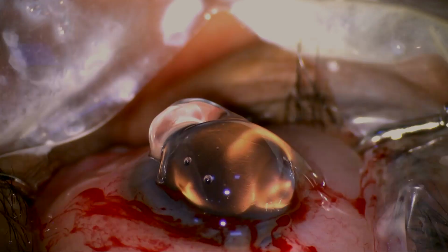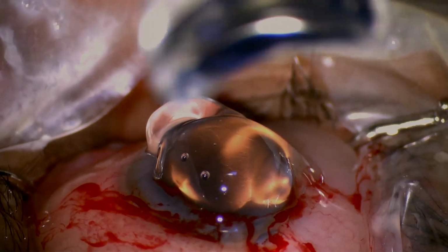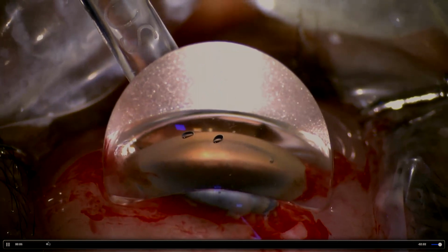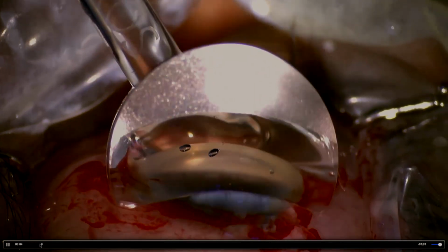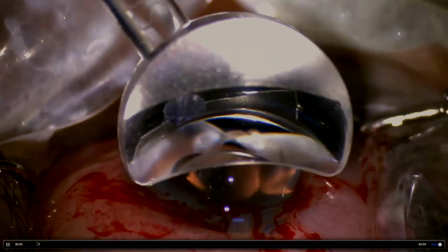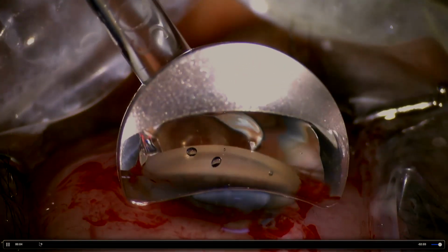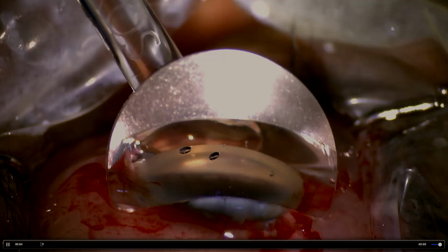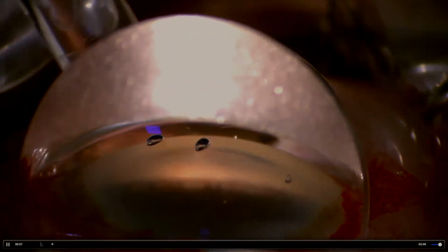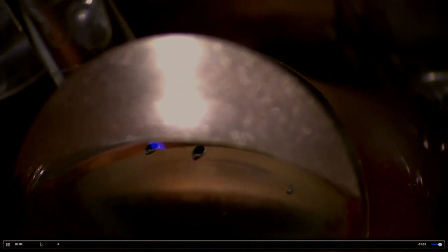And the AGM reduction shows a similar rate, but the IOP reduction shows a slightly higher one compared to the AGM reduction. So the procedure, this is an unedited video. I wanted to show an unedited video of the KDB procedure here. I just want you all to notice this particular thing. You can see that the field has a lot of blood. When you place the lens, you can see the centrifugal distribution of the blood. So once that happens, try avoiding taking off your gonio. Once you remove the gonio, again a centripetal rush takes place. So that is something you need to avoid.